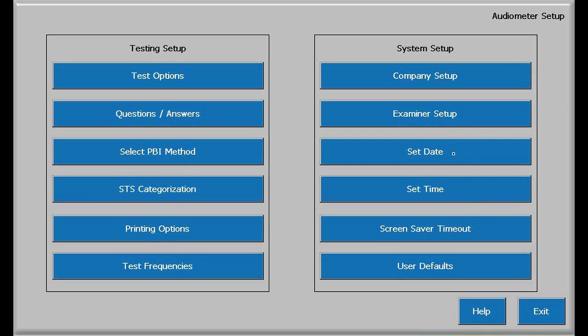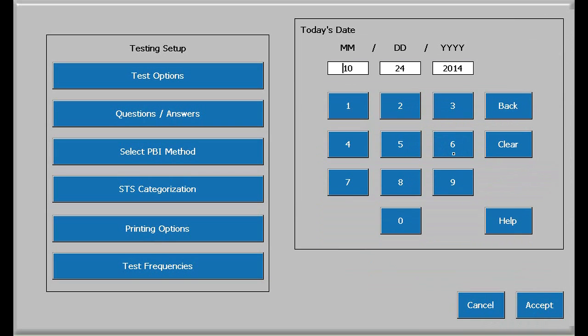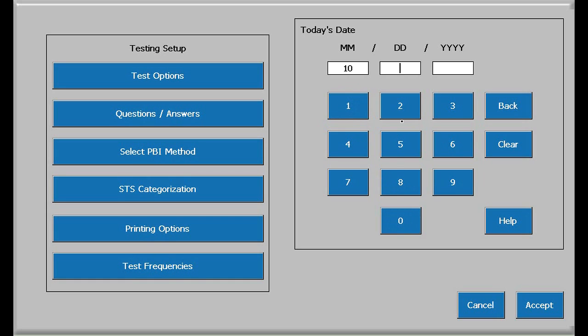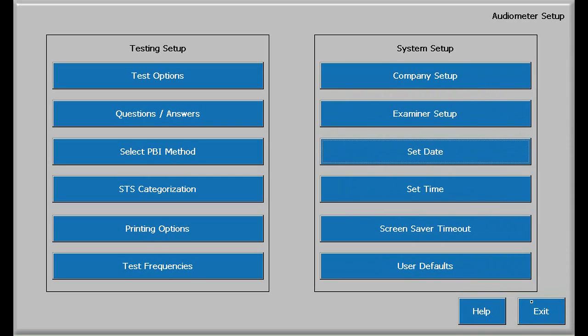Setting the date is next. If the date as entered at the factory is wrong, touch clear, and then re-enter the date in month, day, year format. Use four digits for the year. Press accept. It takes a few seconds for it to enter this information, so just be patient.